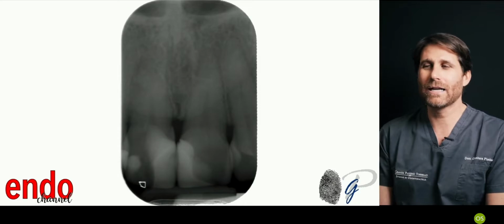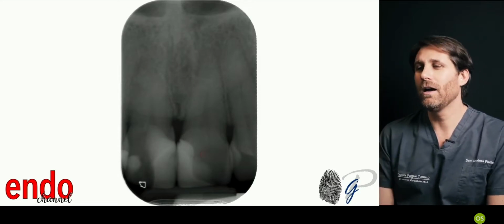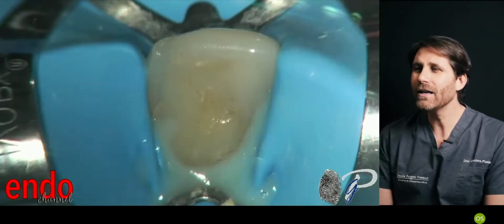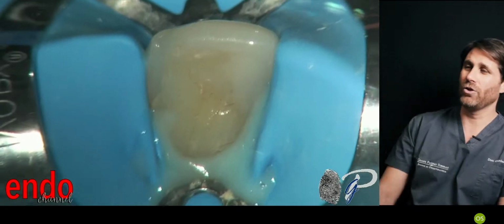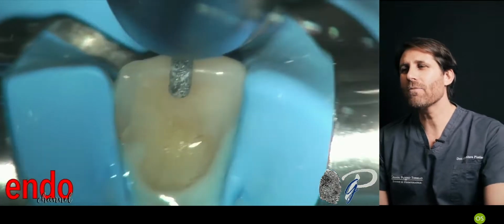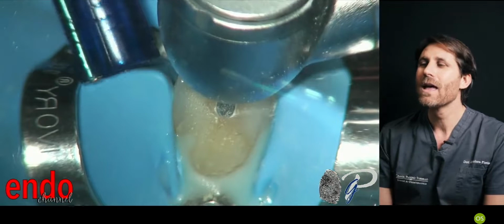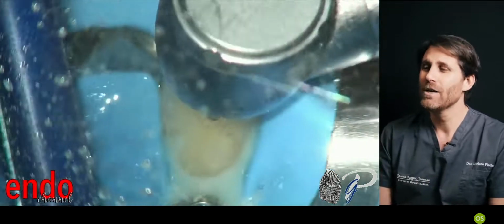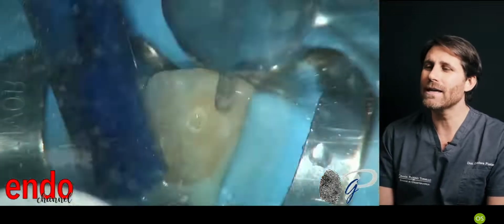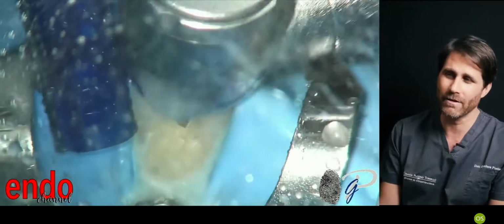And this is a clinical example. Central incisor, we need to treat it because of necrosis after coronal filling. Again, perfect isolation of the tooth. Look at the inclination of the burr. The inclination of the diamond-coated burr to open the enamel is parallel to the long axis of the tooth, palatal to the incisal edge. So the first rule for me, especially in the upper incisor: never touch the incisal edge. Stay palatal to the incisal edge. This is for aesthetic reasons.